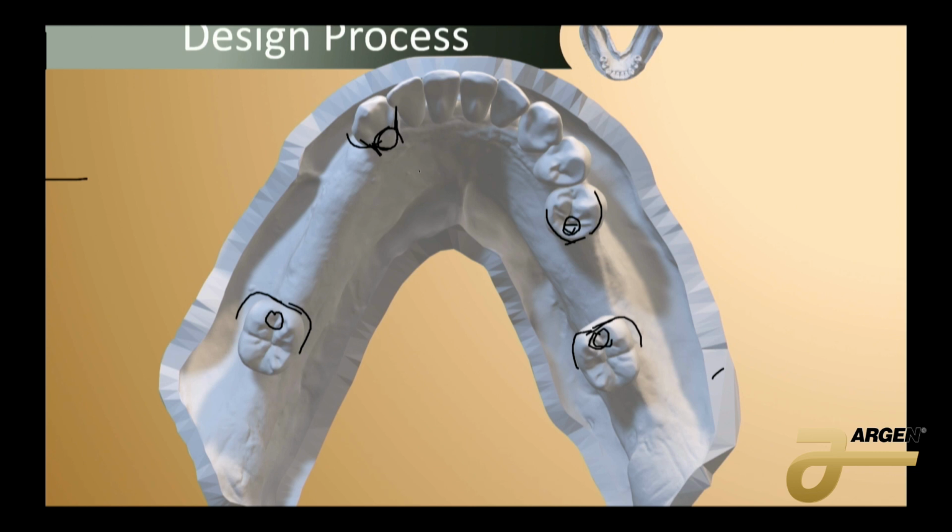Now the major connector, maybe we do not have enough space. Maybe this is not a deep enough tissue. It's really shallow. We can then, instead of resting this, just do a plate across here. Plate, plate, plate. This mouse is not working the greatest, guys. Come across as a plate and then come down. And when we're plating it, again, we're protecting for the future. We can add teeth onto it. It's acting as a reciprocating element in case they lose those back teeth.